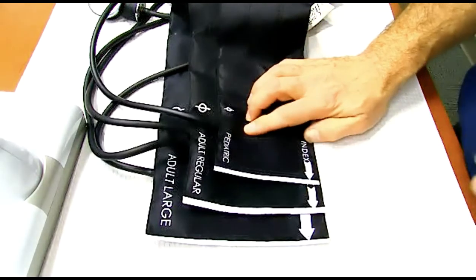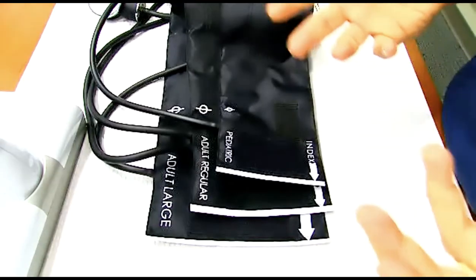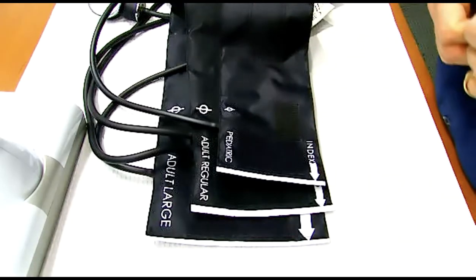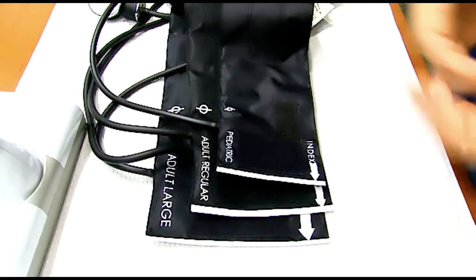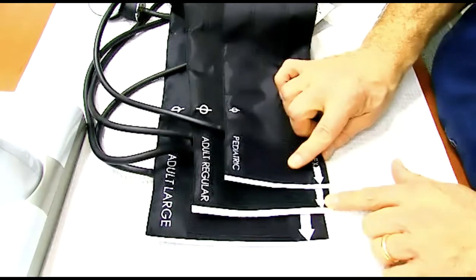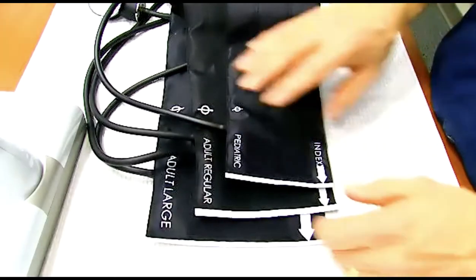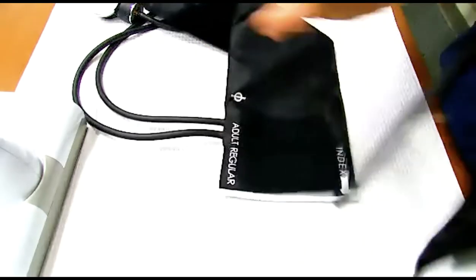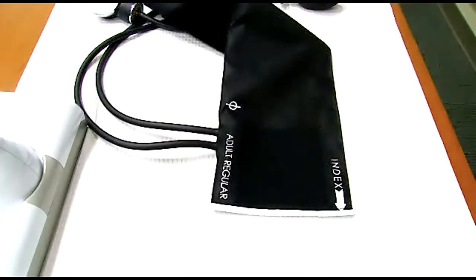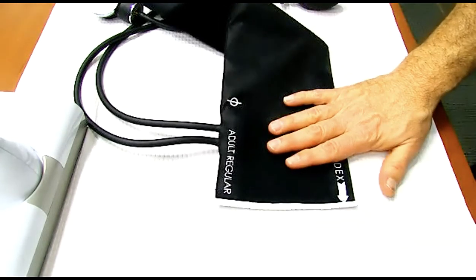But it's important because if your cuff is too large, then they give you an artificially low blood pressure reading. If the cuff is too tight, it barely wraps around before you even do the blood pressure, then the readings are going to be artificially high. So it is important that you do have the right size cuff for your patient, okay? Now, having said that, the ones that we made you buy are not exchangeable, so you're going to have to use the adult regular. That works for most patients, but realize in the real world, there are patients where this cuff size might not be appropriate.